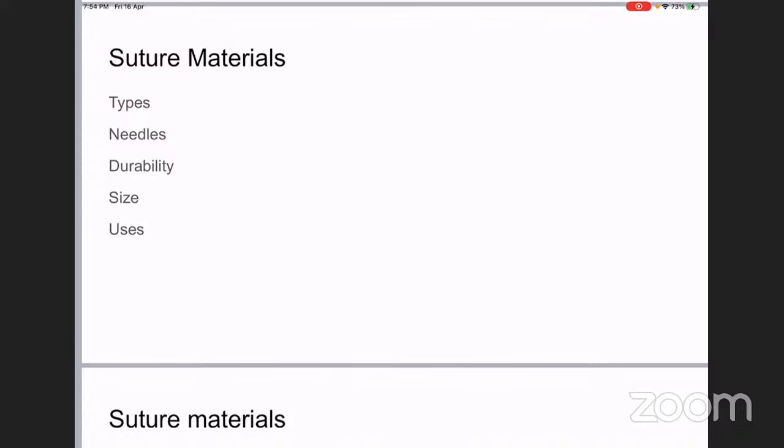what kind of suture material is silk? Is it a polyfilament or a monofilament? Anybody in the audience? Poly. Very good. It is a braided polyfilament suture material. So several threads of silk are braided together to form a silk suture. So that is one other way of classifying the suture materials. Monofilament is a single thread. Polyfilament is several braided threads forming one suture material. So this is how you classify them based on their structure.